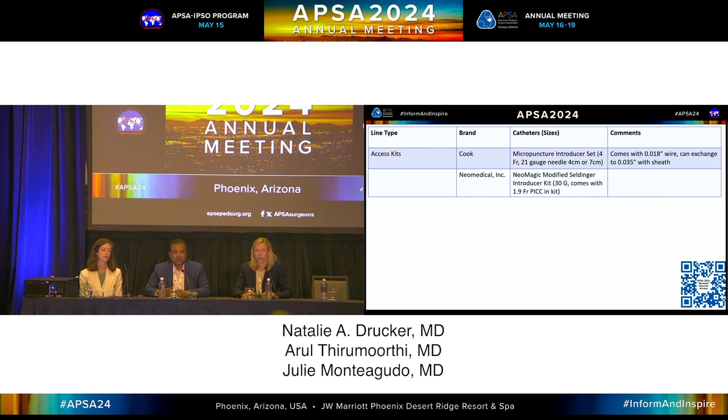And so that's why we didn't get into it too much. We were trying to talk about the things we know. It is an option, but we know people have found it not as easy. And EJ cut downs are also an option that we didn't discuss. A 2.7 French Broviac generally slides right in.